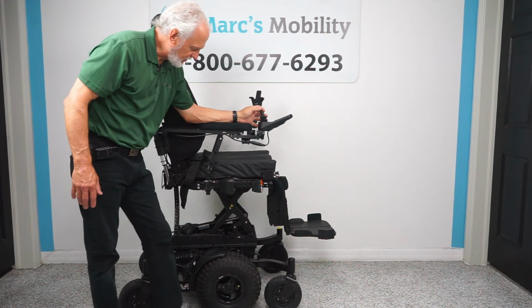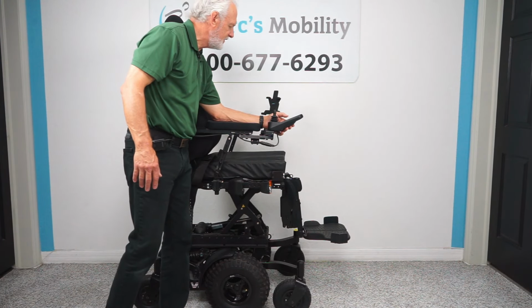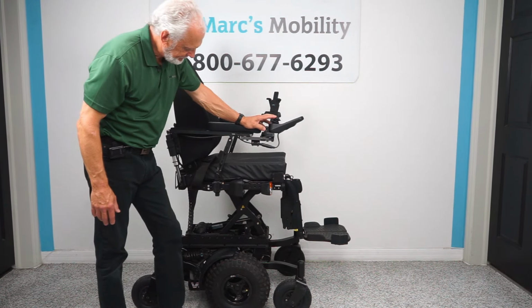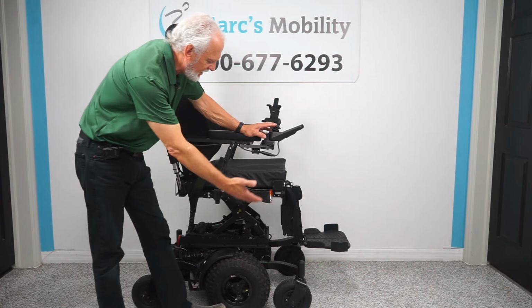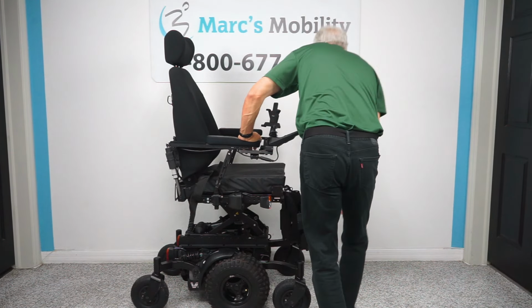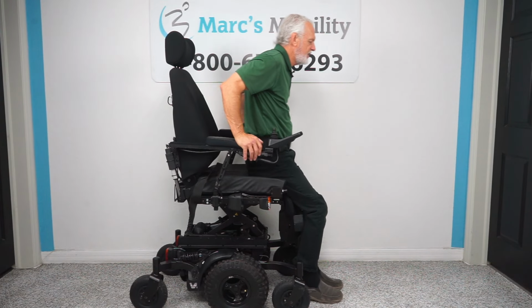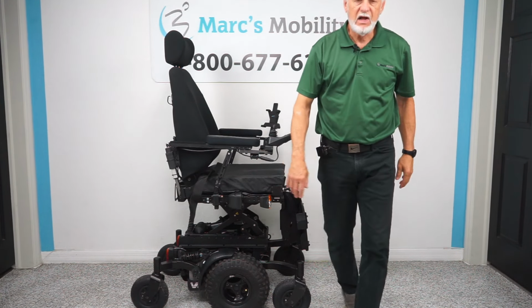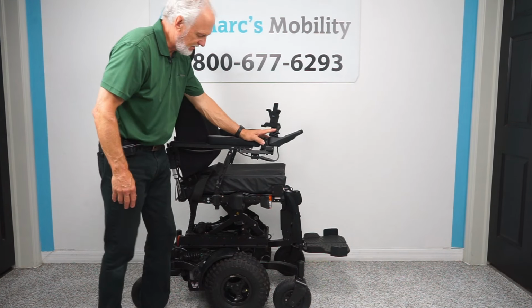Another thing with this chair, let me put it back over here. Let me put it back on the seat. Let me bring the seat down. If you have trouble getting out of your chair, let's just say you're able to do that and you have trouble getting out, you can flip this foot plate up, and when you get out, push yourself here. It really makes it a lot easier to get out of the chair with the seat elevated, okay?